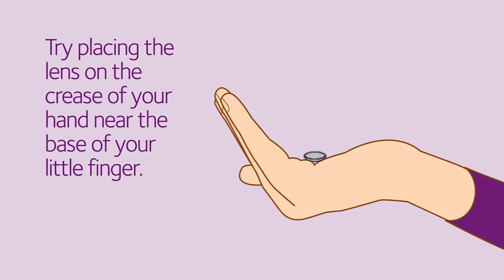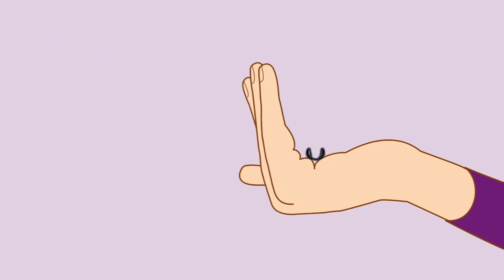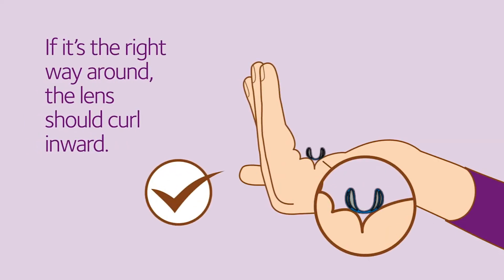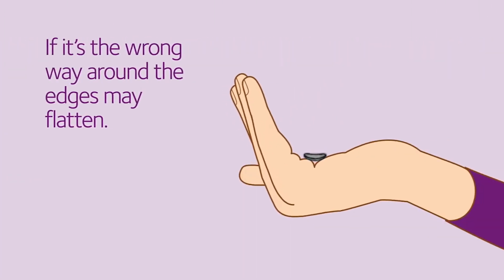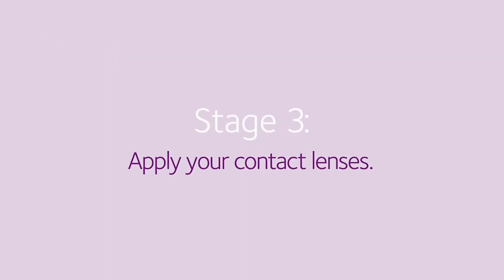Look at the shape of the lens as you move your little finger. If it's the right way around, the lens should curl inward. If it's the wrong way around, the edges may flatten.